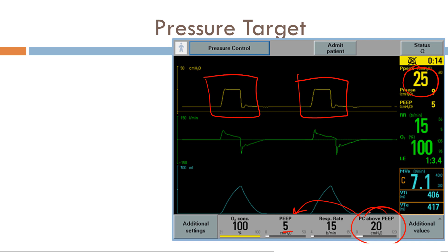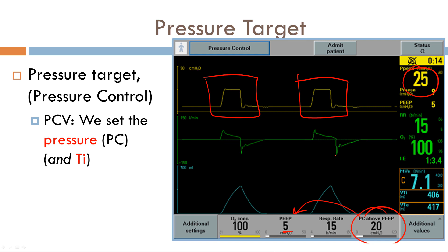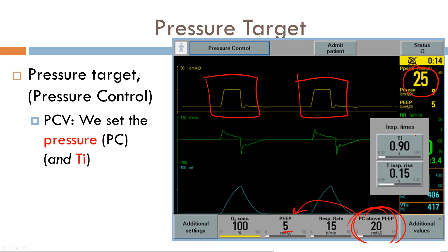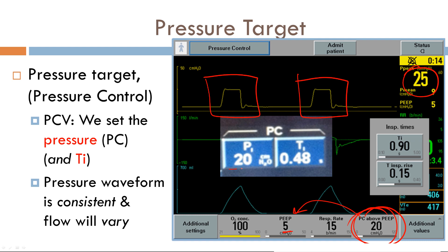What varies and is the dependent variable is flow. Looking at the flow scalar, the morphology is completely different between breaths — just by looking at the flow scalar, you can see that it's different and is the dependent variable. In pressure control ventilation, the target variable is pressure. We set the pressure control as well as something called inspiratory time. The pressure waveform is consistent and does not vary, but the flow here varies. On the Puritan Bennett, you can see that the pressure and inspiratory time can be adjusted accordingly.